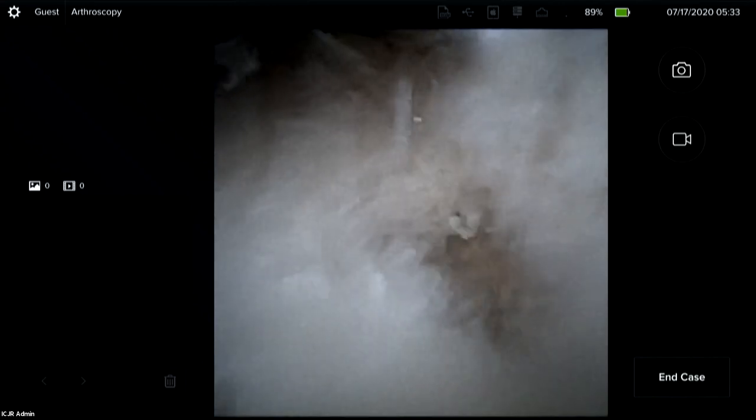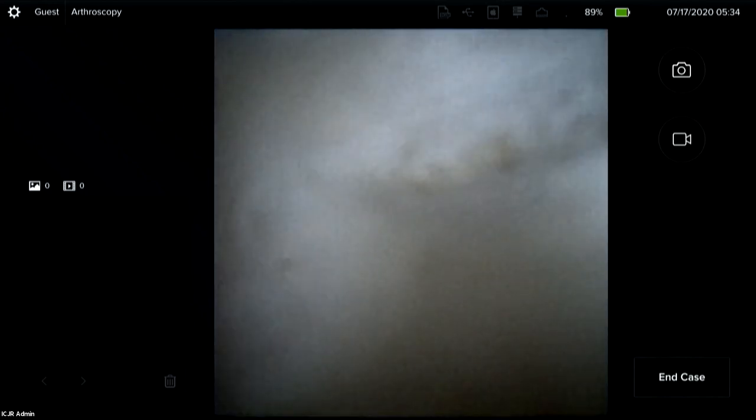Here is the foveal TFC tear. I'm maneuvering my probe there — you can see the TFC is mostly detached from the fovea. This patient also has a central perforation of the TFC, which would be more of a degenerative tear.